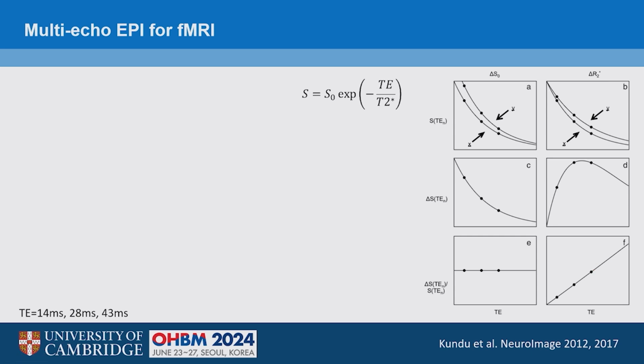What we can do with that, if we take the time series from an independent component analysis or similar, look at what the fMRI signal is, we can predict from the way the signal behaves whether that particular series is BOLD or non-BOLD. And so that's an approach that can be used.